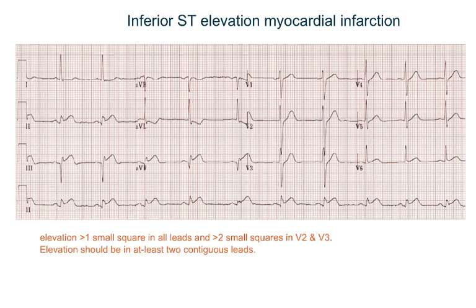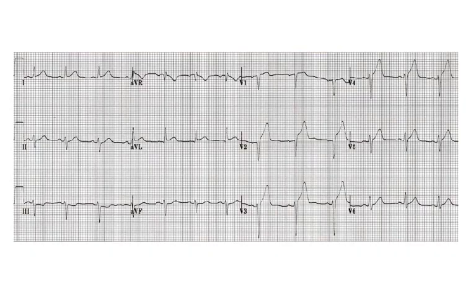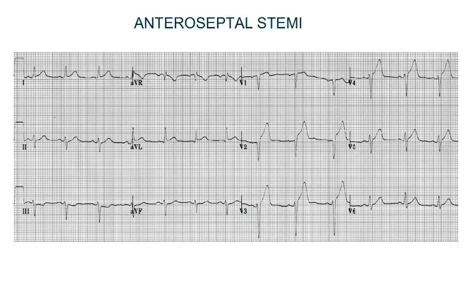Contiguous leads means two leads that represent the same area of the heart. For example, in this ECG you see ST elevation in lead 2, lead 3, and lead AVF — so this is inferior ST elevation MI. In this other ECG, the ST elevation is in leads V2, V3, and V4, so this is anteroseptal ST elevation MI.